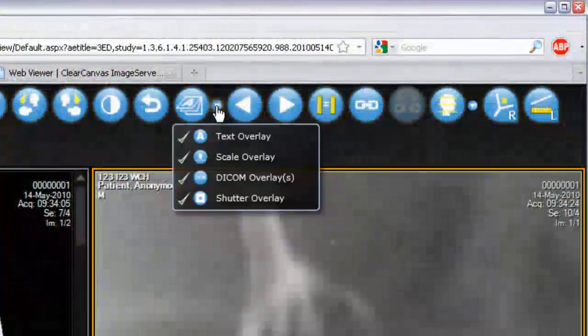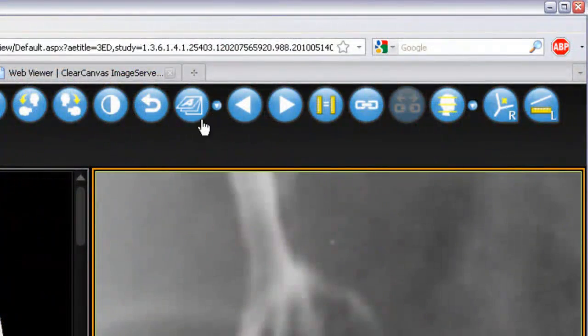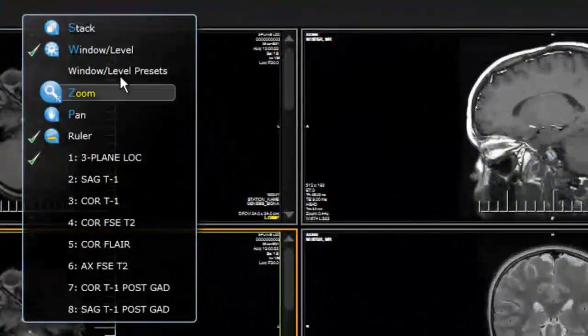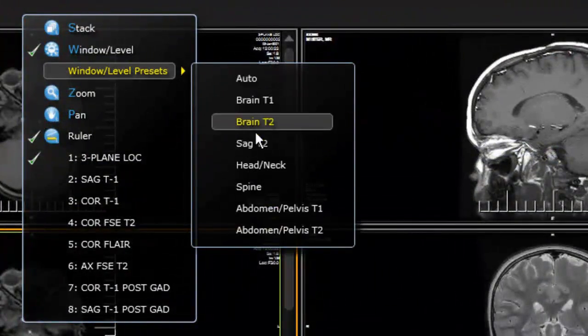Note that the image processing is entirely server-side, making the ClearCanvas webstation a truly thin client.